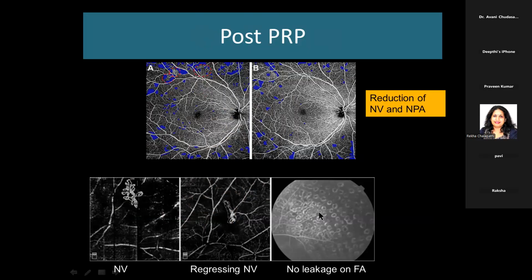And this can be proved on FFA also in the same patient. There is no leakage. So OCTA changes invariably correlate well with the FFA. So you need not do FFA in all these patients.